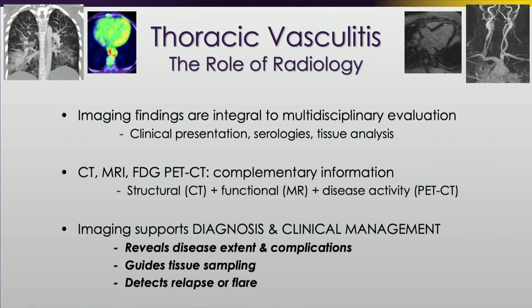So yes, imaging findings are integral to multidisciplinary evaluation, including history, serology, tissue analysis, with supportive imaging findings. And our imaging modalities that we can offer include CT, MRI/MRA, and FDG PET-CT, all providing some complementary information.